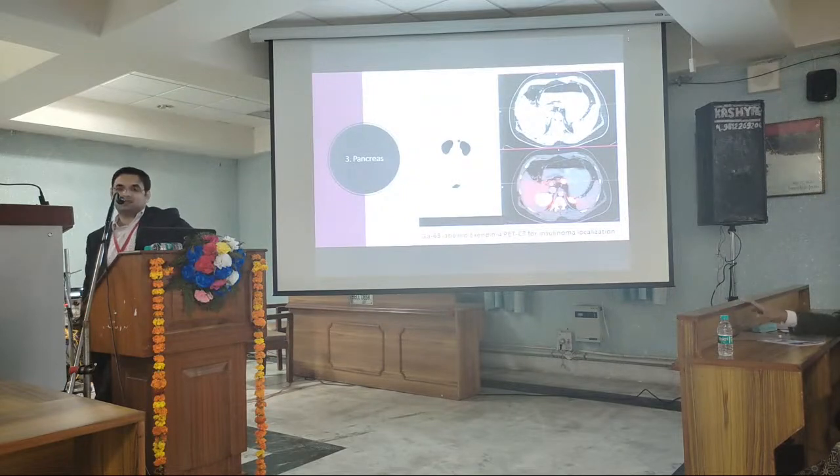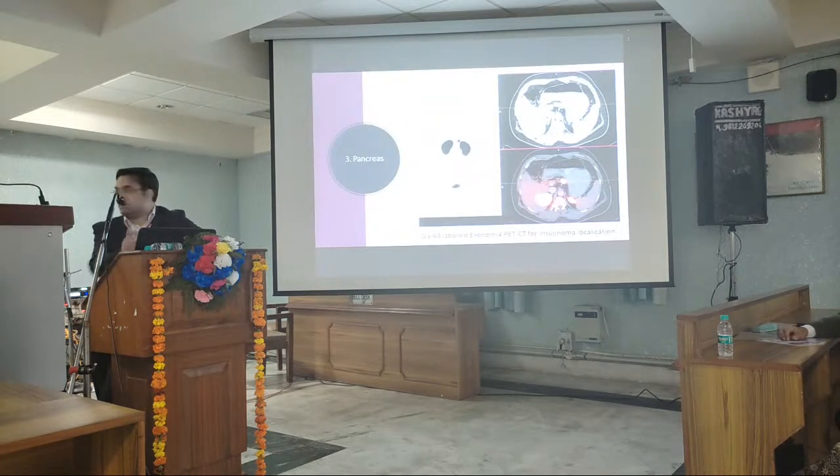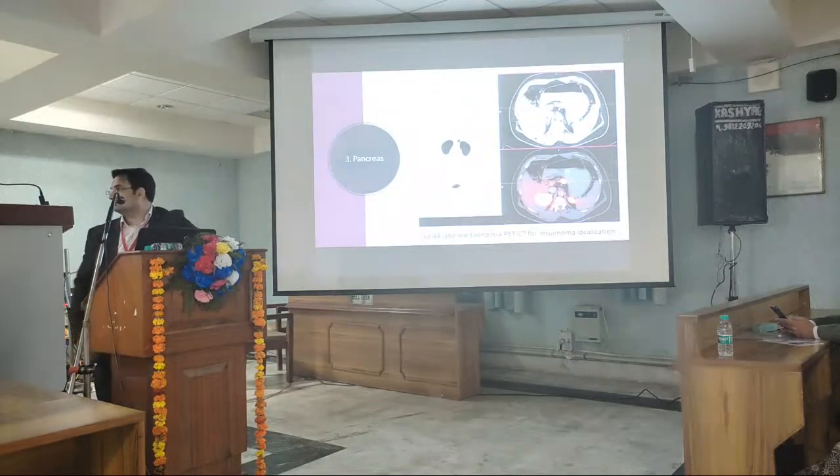No, I think our surgeons have now started sharing our nuclear medicine point of view, and at least at AIIMS, I can share some data with you. We have analyzed almost the last 2000 scans that we have done, and 450 fluorocholine PETs. We have evolved a very robust system where our surgeons come to us one day prior to surgery. They see the scans on the console and we provide them the view. And with fluorocholine, I must say that we have been able to localize in the de novo setting.